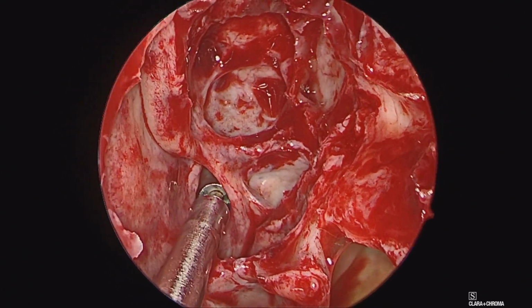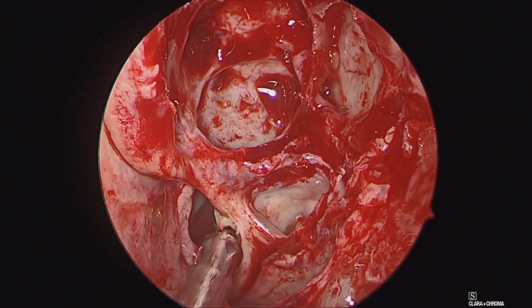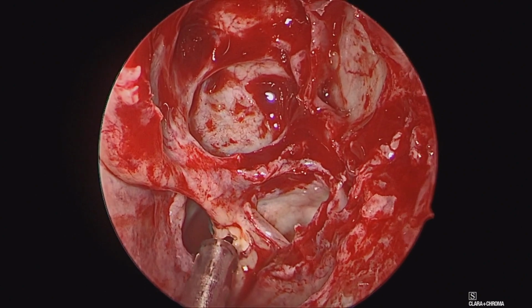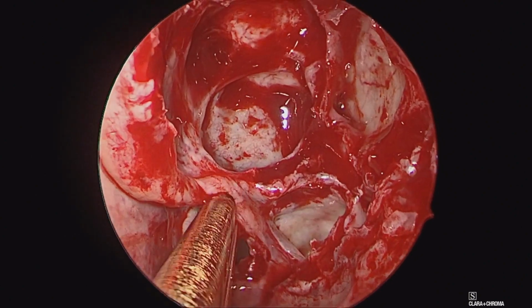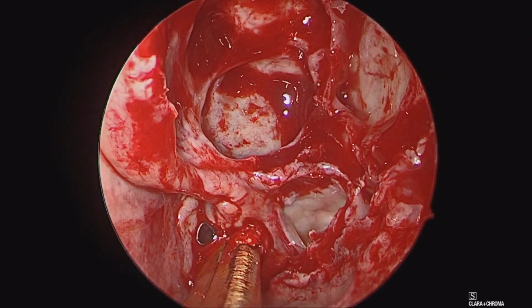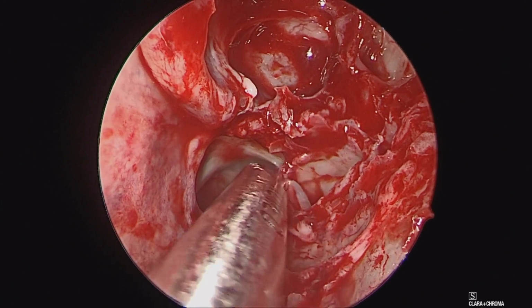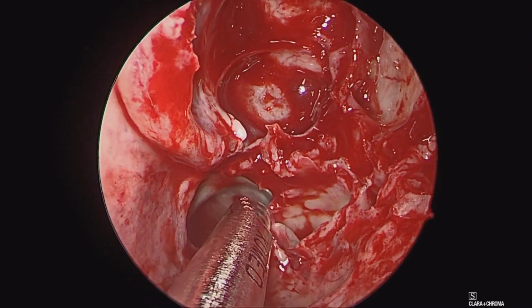And then in order to facilitate access and long-term surveillance, here we are opening up the sphenoid sinus widely. You can see in this case, there's a bit of an onodi cell, or a posterior ethmoid cell, pneumatized just over the face of the sphenoid, but here we are through the natural ostium of the sphenoid sinus, and then opening that up widely, laterally and superiorly up to the planum for long-term surveillance.